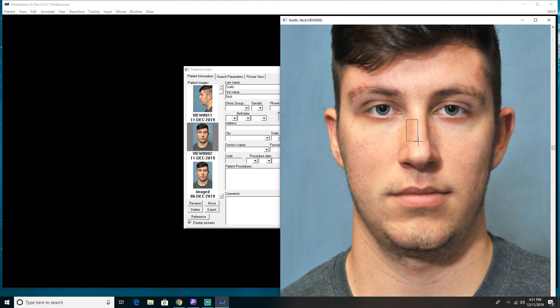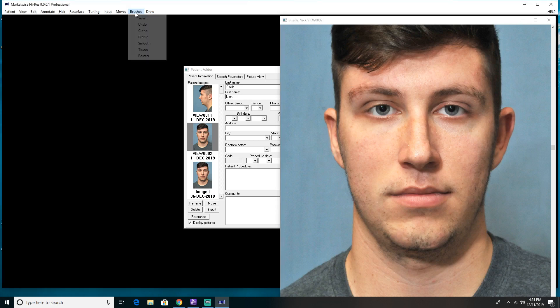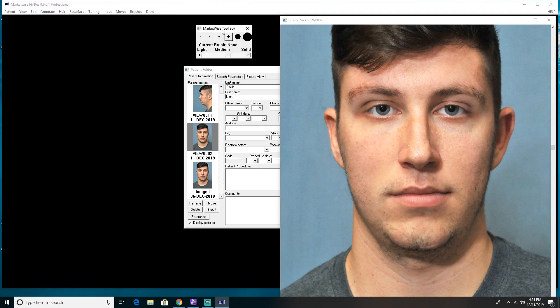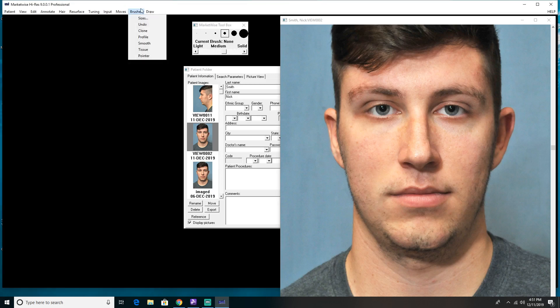There's also a corresponding dorsal shadow here. I'm going to push that out a little bit. Now we have a good shape on this young man's nose, so I want to go to the tissue brush. I'm going to go back up to the top banner and choose Sizes — that opens up my toolbox. My current brush is none, so I'm going to go back to Brushes and choose my tissue brush.